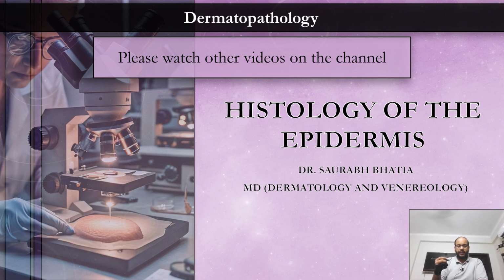So, first of all, for any biopsy that you analyze, especially in the initial stages of residency while you're learning dermatopathology, the description starts from the epidermis and goes downwards to involve the dermis and the subcutis. So if you're describing a slide, it's better to describe it from top to bottom. With time, as experience increases, you might go directly to the most evident and most prominent findings. But even if you're not describing it from top to bottom, the idea to examine the slide should be from top to bottom. That is, you start from the topmost layer of the epidermis and you go downwards till you reach the end of the section or the subcutis.